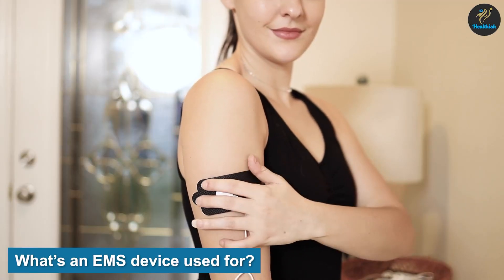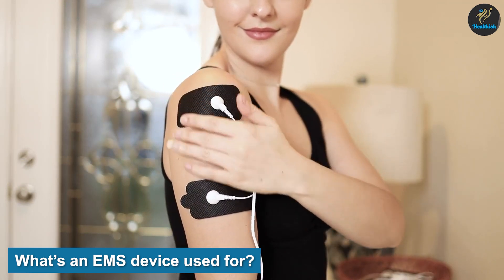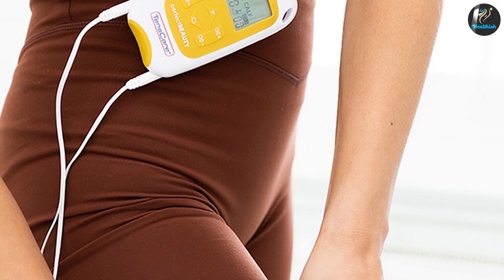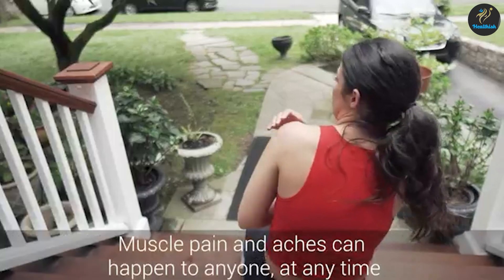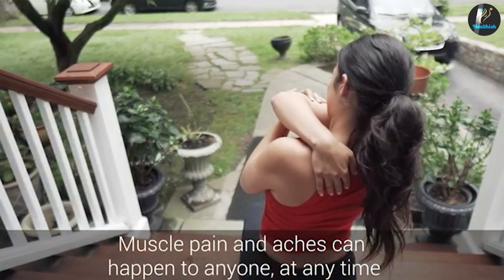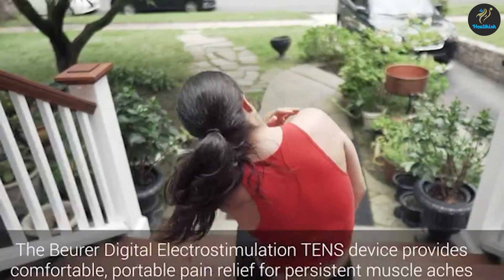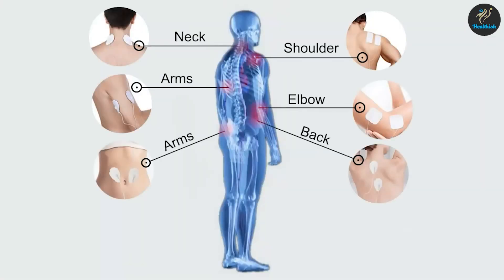What's an EMS device used for? EMS devices are used to jumpstart muscle contractions, otherwise known as neuromuscular re-education. They may be found in fitness centers, as well as in physical therapy and rehabilitation clinics. Many EMS devices are also designed and sold for at-home use. The electrical impulse from an EMS device is stronger than that from a TENS machine. An EMS device shouldn't be used to treat pain and may cause damage to wound sites and incisions.